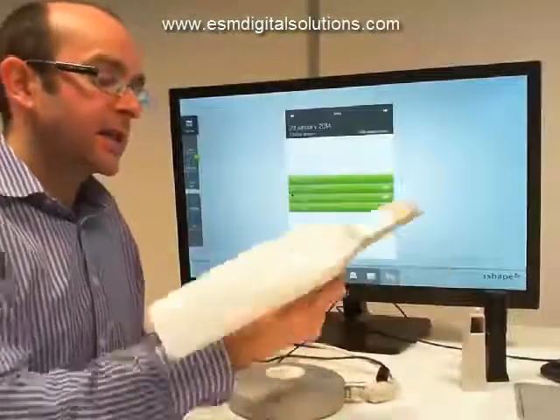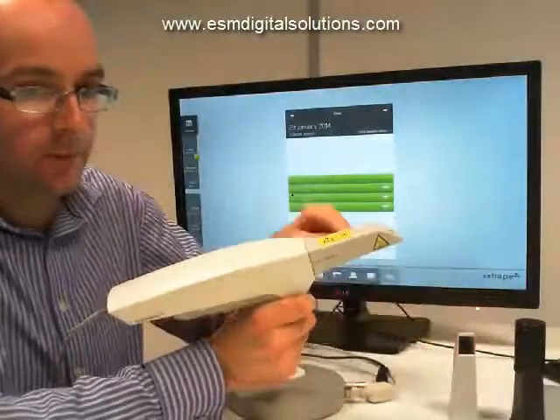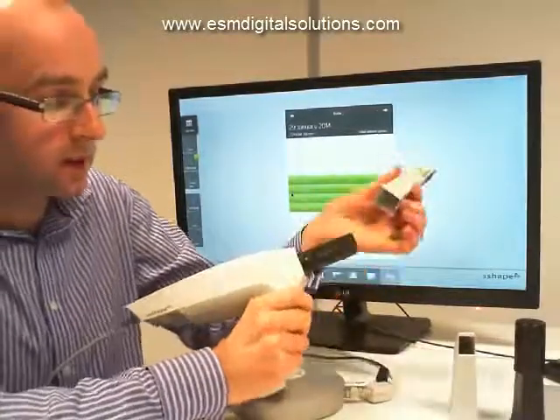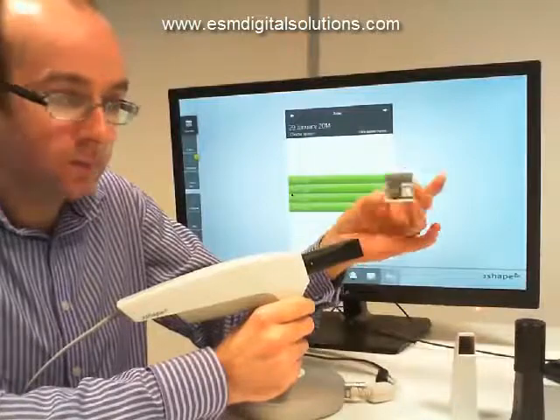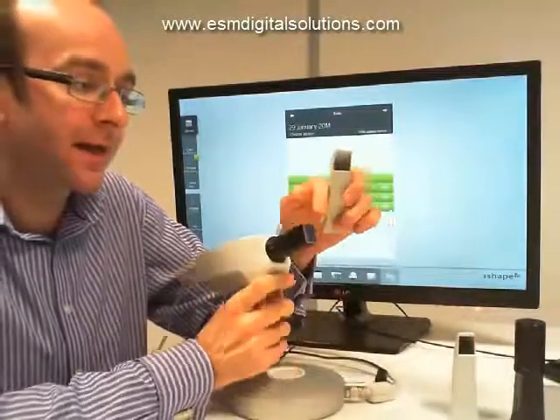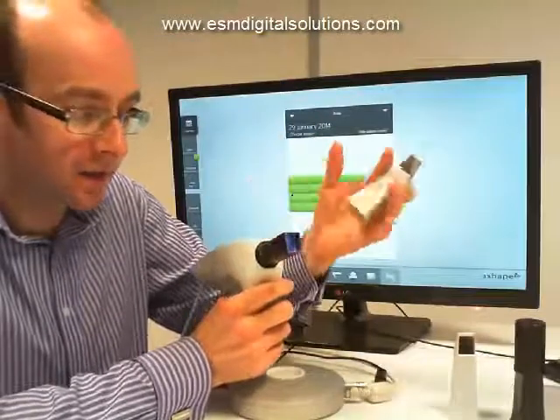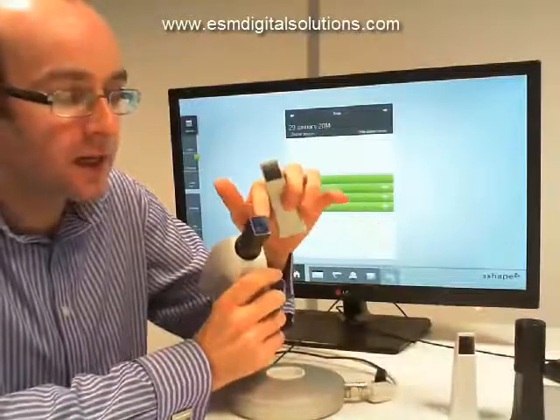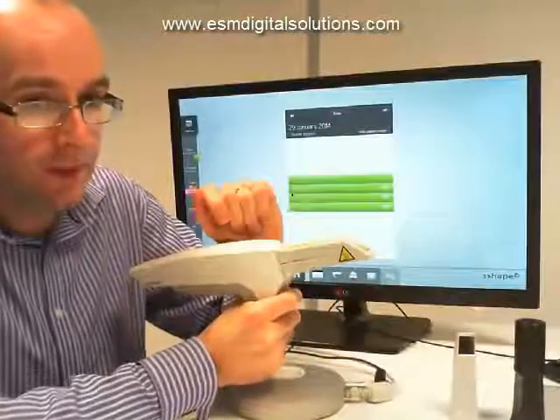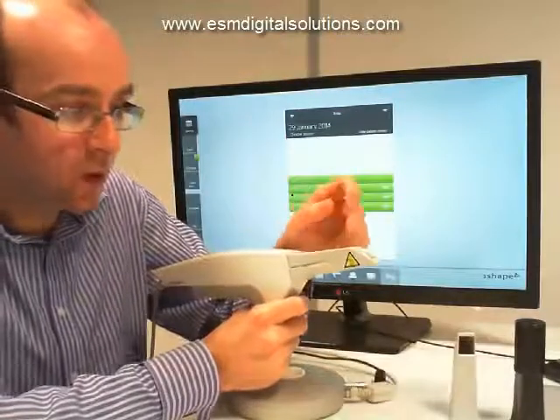Going back to the scanner itself, we have three different scan tips, each with a different application. The tip currently on the scanner is simply a protective tip — it's purely a plastic covering to protect the tube. We refer to this part of the scanner as the scan tube. At the end of the scan tube there's a highly polished glass lens — it's an optical device, so we need to protect that lens, keep it clean and make sure it remains undamaged. The protective tip's job is to keep the optics well protected when the scanner is not in use.